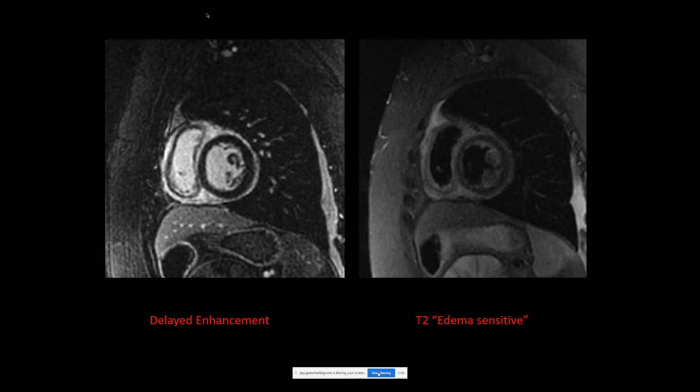We've taken to, you have to be really careful with the trigger delay. So the recommended trigger delay on these vendors generally doesn't work. They've been set to try to go fast, to go quick breath holds. But it's just like cardiac CT. You have to correctly set the timing in the cardiac cycle and have it short enough that there's not too much motion there, because it's a very motion-sensitive sequence. So you have to go to a fairly short echo train, like 14 or 16, whereas the default is like 26 or 28.